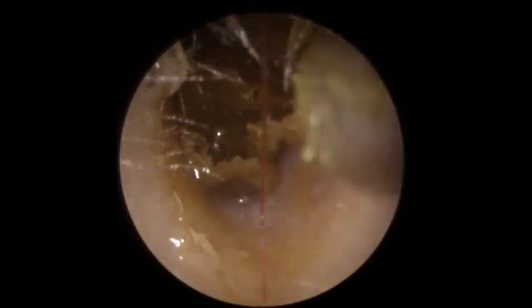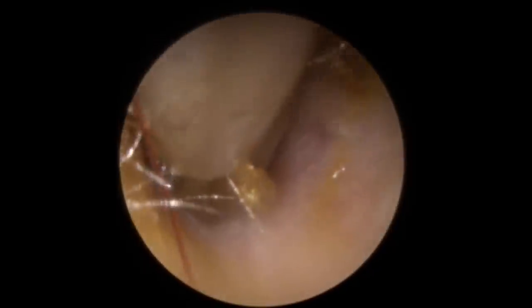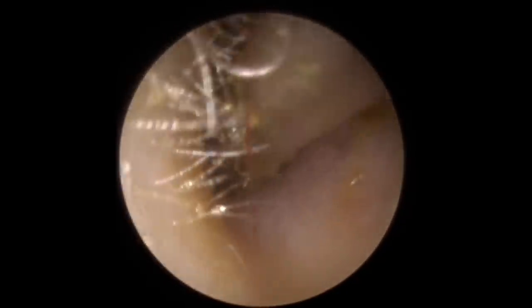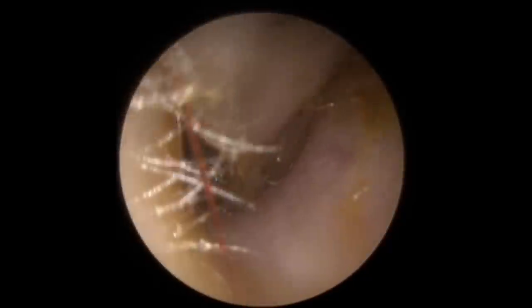Spray a little bit of olive oil in here just to reduce some of the stickiness around the outside edge. You can see we've got a redness here and there as well. Just getting a grip on this, trying to aim above that little bit of skin that keeps flicking up there to try and get to the wax beyond it. But that little bit of skin is really getting in the way, so we're going to get a good grip on it and hopefully detach it. Wiggling it back and forth — you can see it's starting to get sucked into the machine, which allows me to get to the wax sitting behind it. That little bit of skin was just holding it in place.